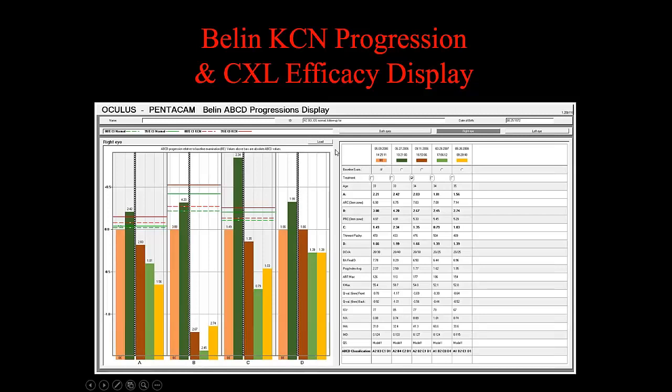The user will identify the baseline exam, and that obviously shows here as BE. You also have the ability to indicate whether you've treated the patient. In this case, usually we're talking about cross-linking. And you can see here, there's a treatment, you can check it off, and that treatment will show up as this crosshatch here. So again, here we will show up to 8 exams over time. You can identify your baseline exam, and you can identify when and if treatment was done.